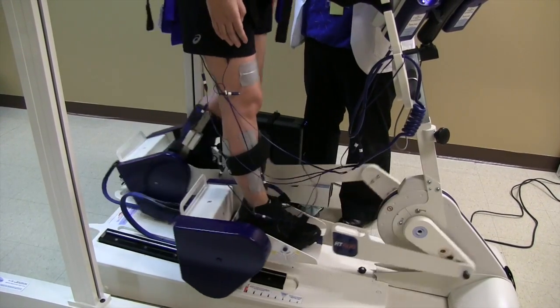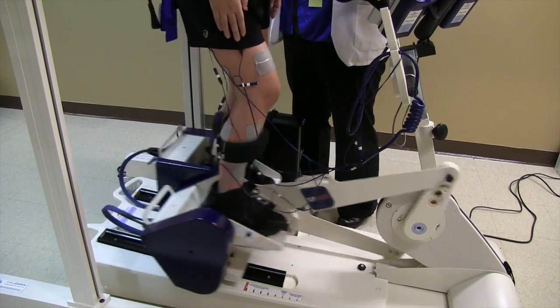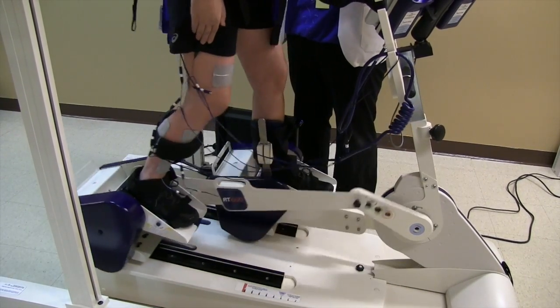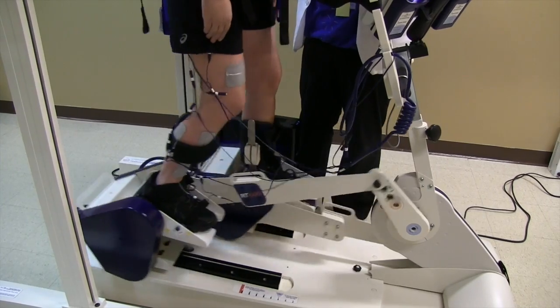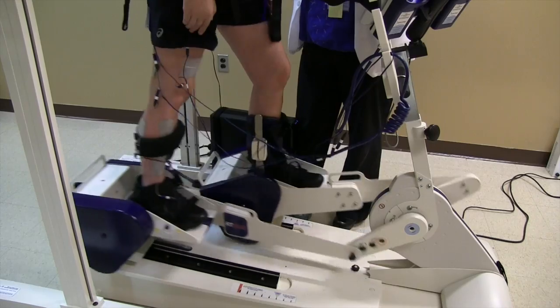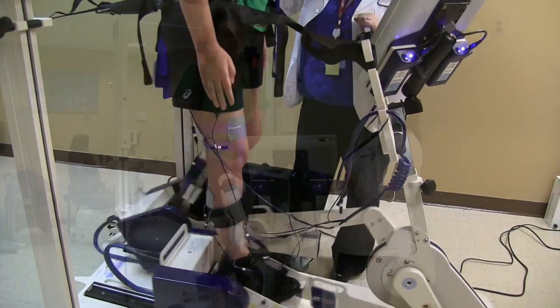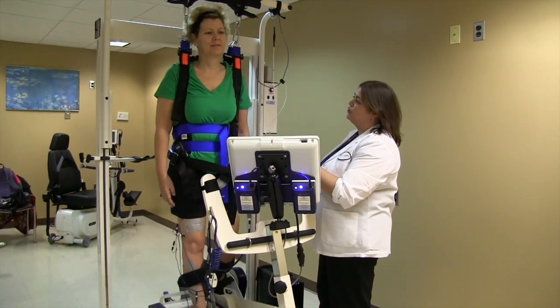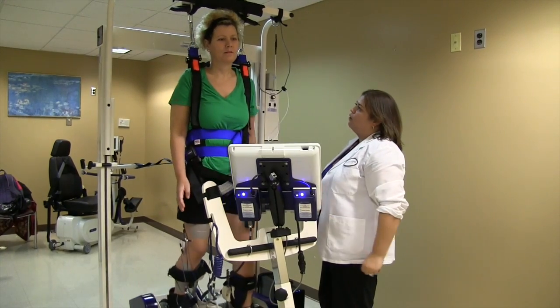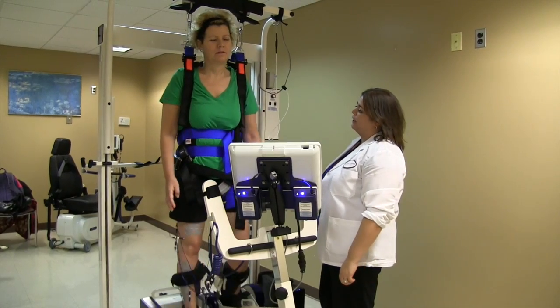The front of the right thigh is where you get the best contraction — that's where we see the most response to the stim. The rest of the five muscle groups are kind of at a sensory level for you. You feel it, but we're not getting a strong contraction yet. But you're able to tolerate a lot more than when we first started using stim. Your posture looks very good. Try to incorporate that right arm more into the arm swing — reciprocal arm swing with your leg, right arm moves with the left leg, left arm moves with the right leg.